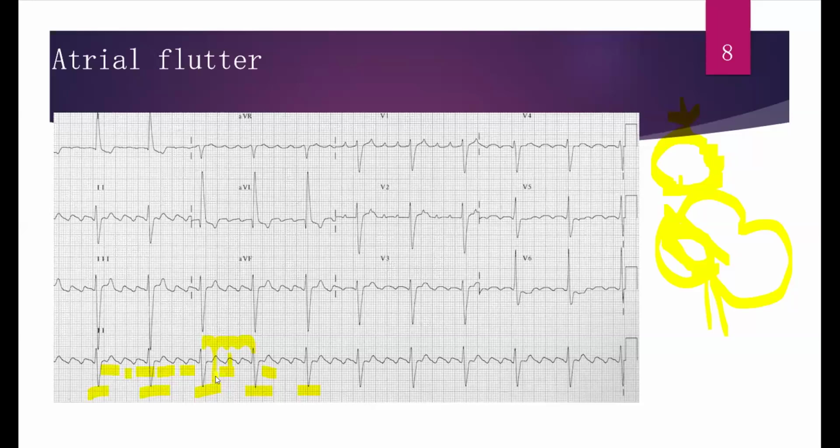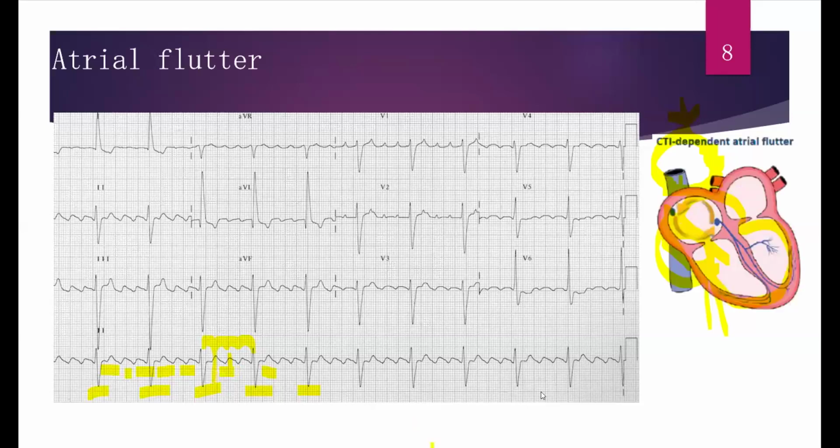And then the other thing that happens is that not all atrial flutter will be regular, right? But even when it's irregular, it still has telltale signs that we look at. It is what is known as regularly irregular, as opposed to atrial fibrillation, which is irregularly irregular. So this is what I was talking about. Let me erase this.